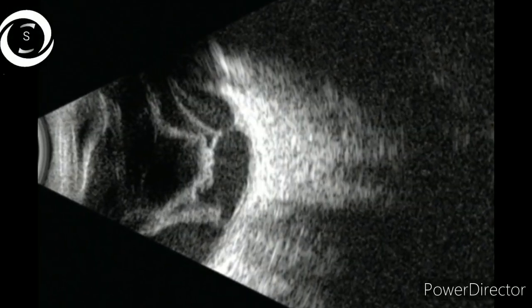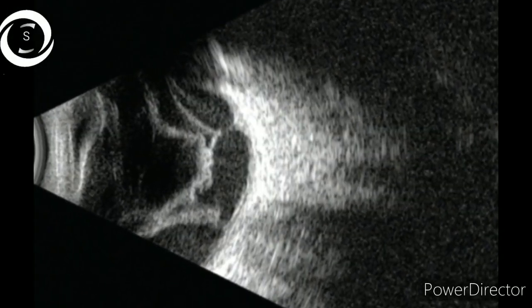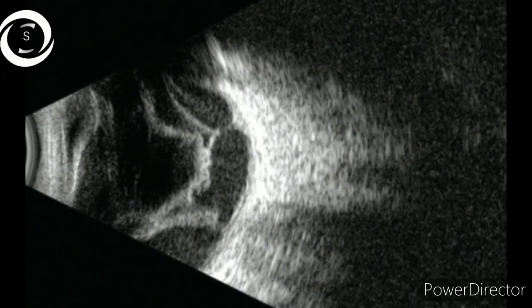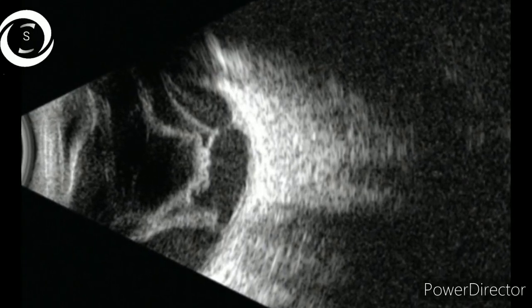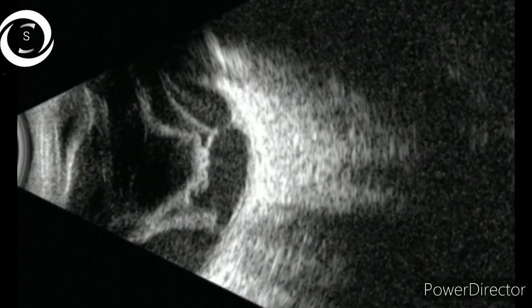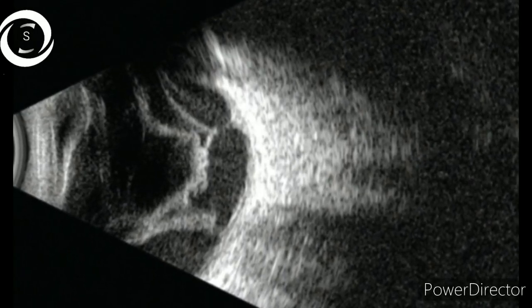In the twelfth B scan, there is vitreous hemorrhage as well as tenting of the retina due to tractional retinal detachment in a diabetic retinopathy patient.